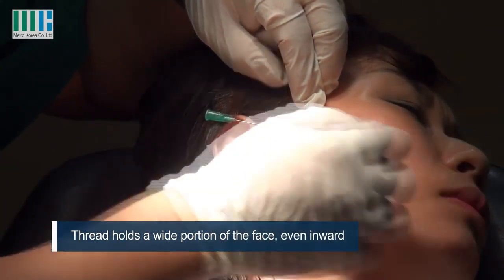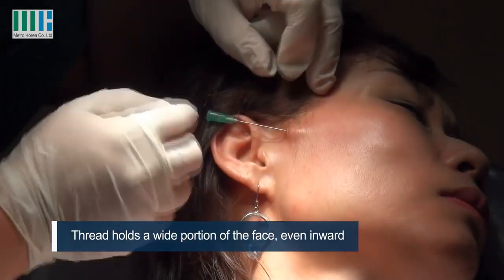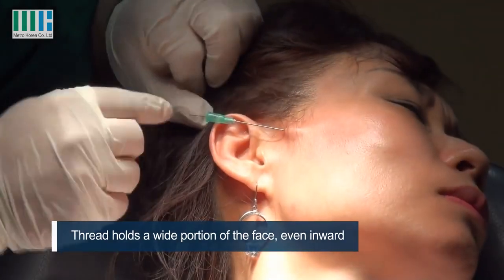The depth is here. You can see the depth is here, and you can see the line is here.